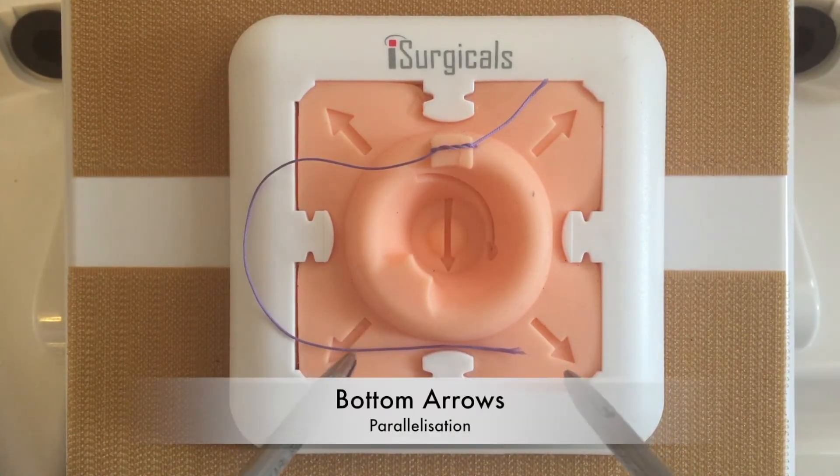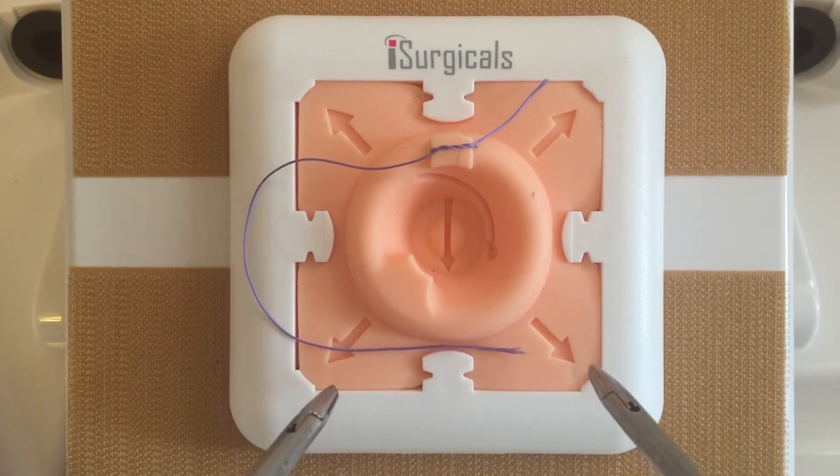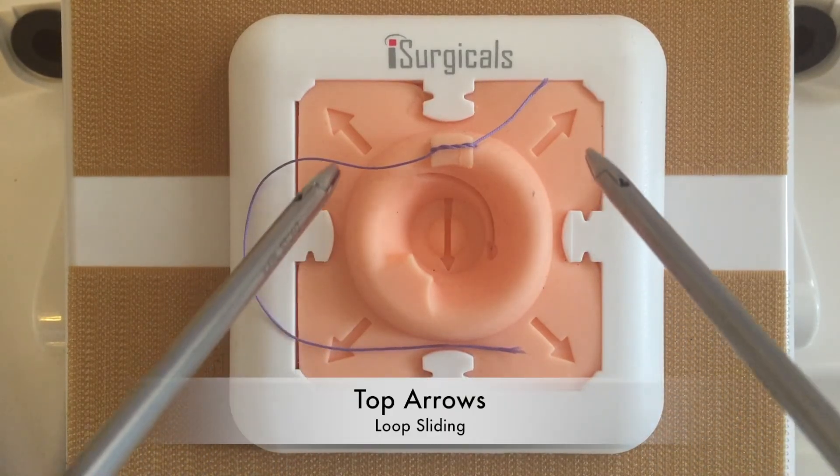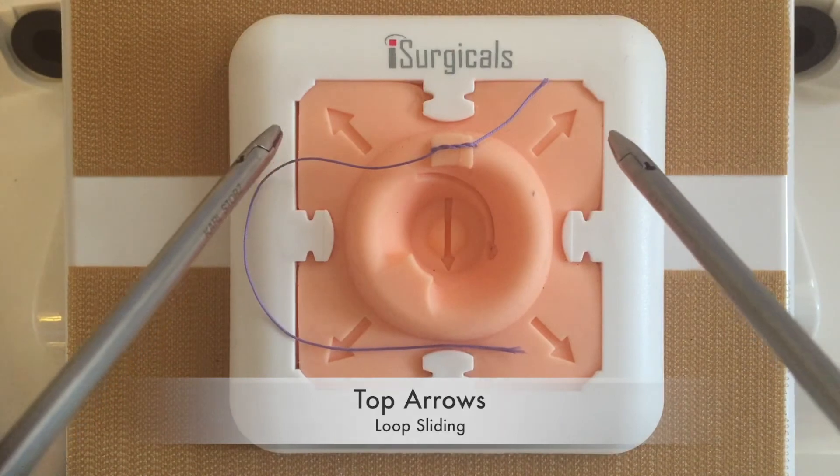The bottom arrows help with parallelisation of the suture with the instrument, which is fundamental when creating a loop to make a knot. The top arrows guide the direction of loop sliding from the instrument before final knot tying.